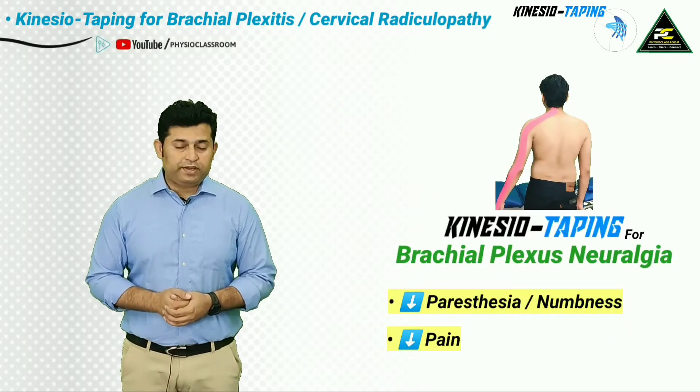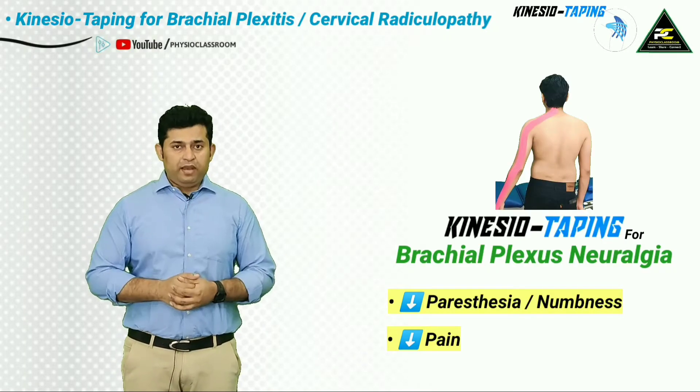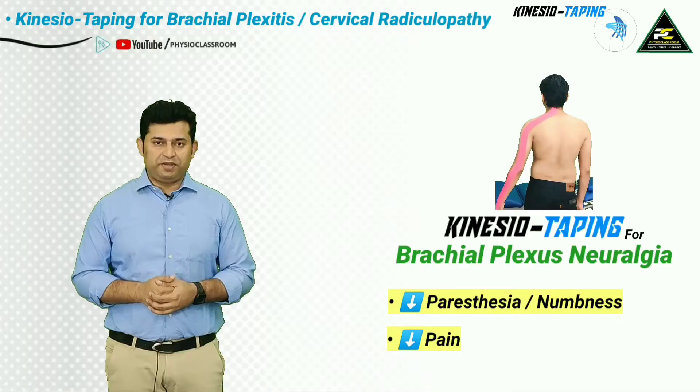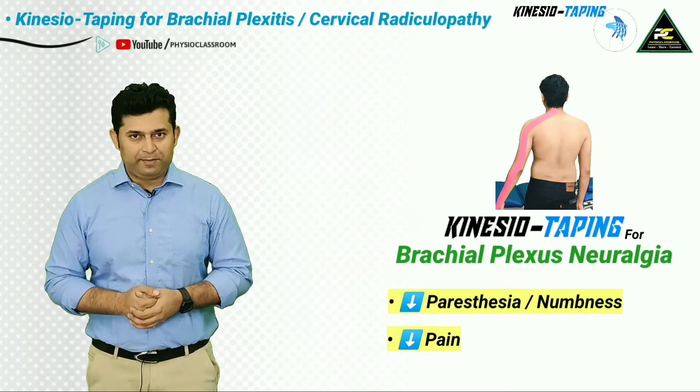The kinesio taping application demonstrated in this video has been shown to decrease inflammation, pain, and paresthesia in such patients. So let's get started with the practical demonstration of this kinesio taping application.